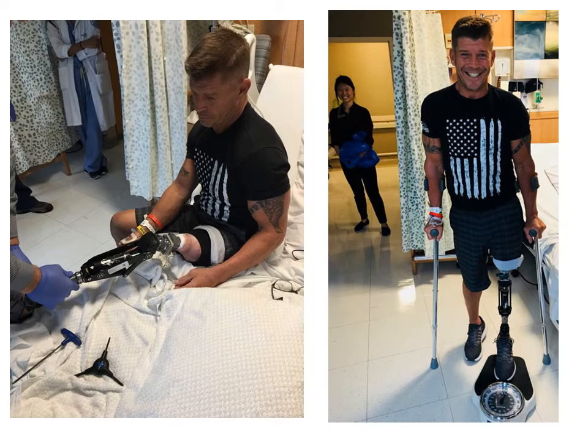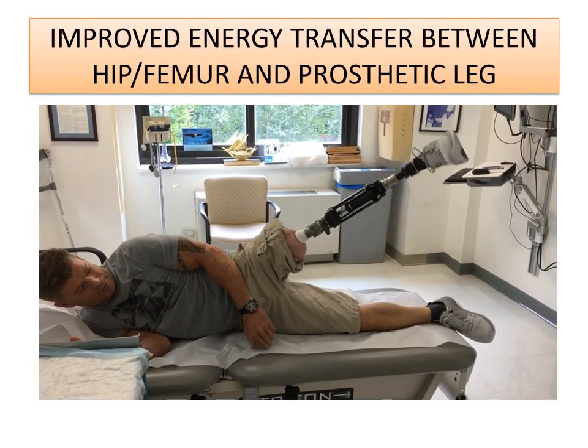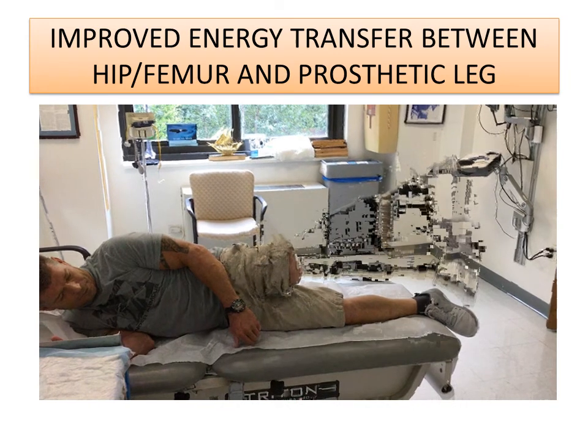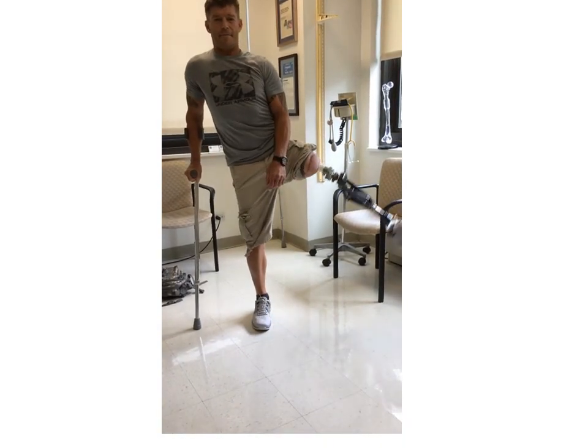This is a picture of Randy on the day that he got his leg connected. We typically will use a loading protocol where we gradually increase the amount of weight and the duration of loading. We have a great team at Hospital for Special Surgery handling osseointegration amputation reconstruction, including dedicated physical therapists and prosthetists and orthotists. One of the main advantages of osseointegration is the improved energy transfer between the bone and the prosthetic leg, illustrated in Randy doing some of these exercises, taken just two weeks after the leg was connected.